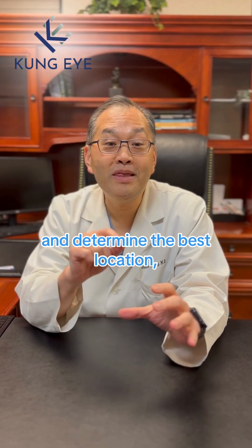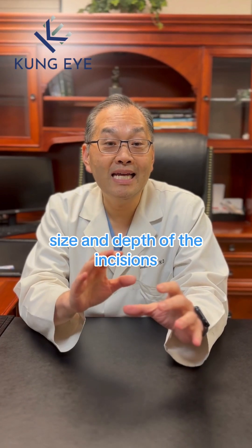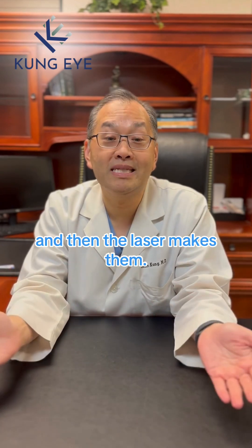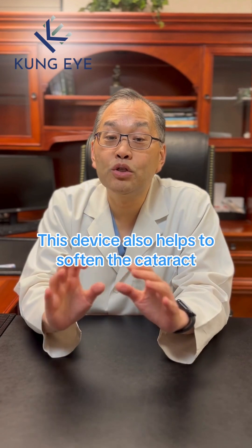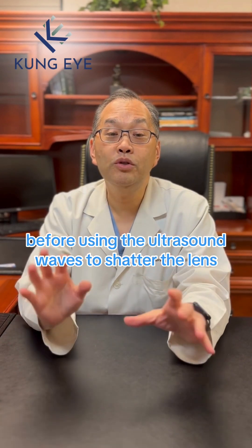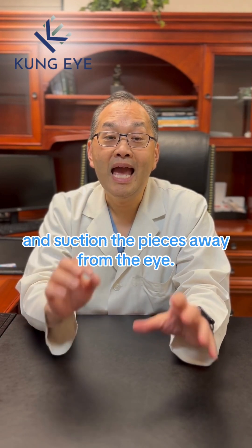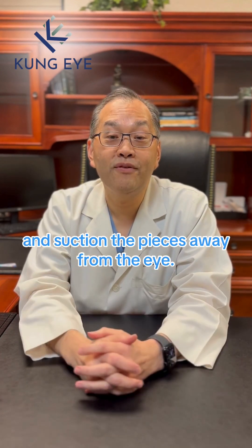The computerized imaging device determines the best location, size, and depth of the incisions, and then the laser makes them. This device also helps to soften the cataract before using the ultrasound waves to shatter the lens and suction the pieces away from the eye.